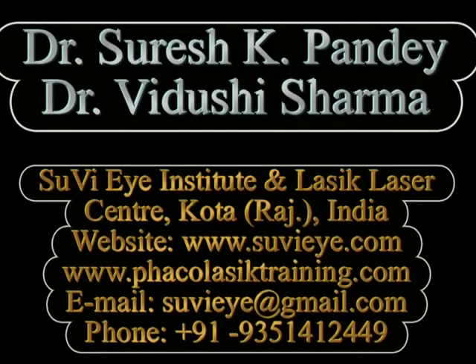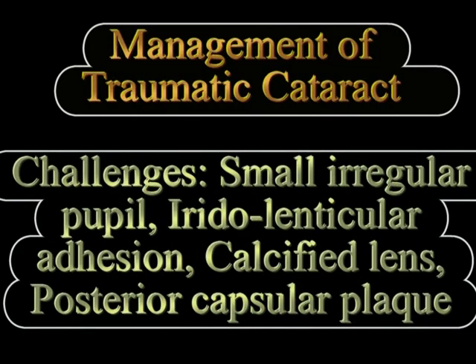Hi, in this video from SuVi Eye Hospital, Kota, Rajasthan, we describe the management of traumatic cataracts and the various aspects in traumatic cataracts like irido-lenticular adhesions, posterior capsular plaques, small fibrotic pupils and calcified capsules, etc.